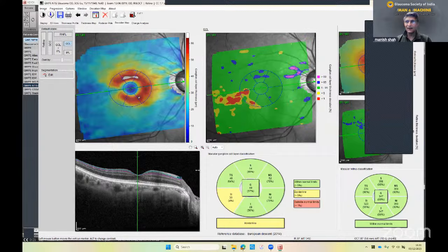Some of these myopic patients have quite a lot of macular distortions as well, and then the going gets tough there, isn't it? Yeah. Also, one more question to Martin: in myopic eyes, do you get more fluctuations, more variation from retest variations?